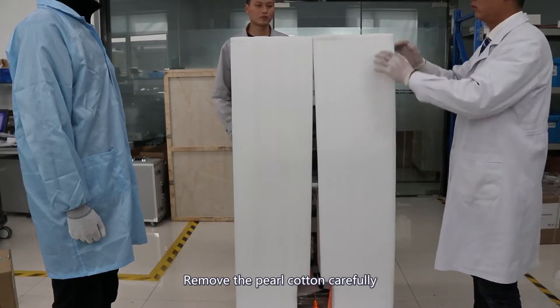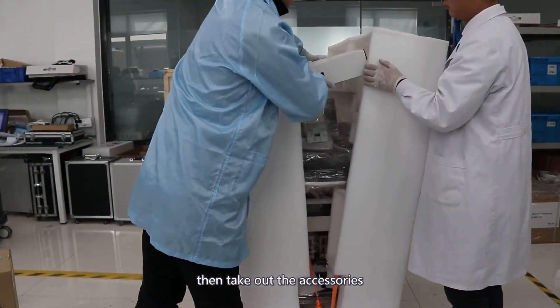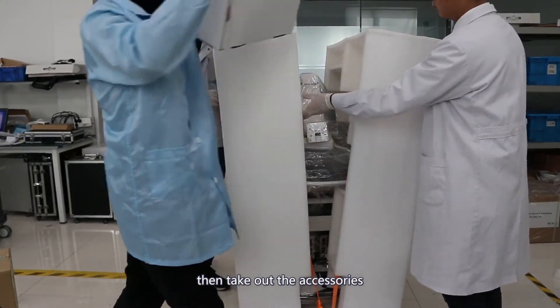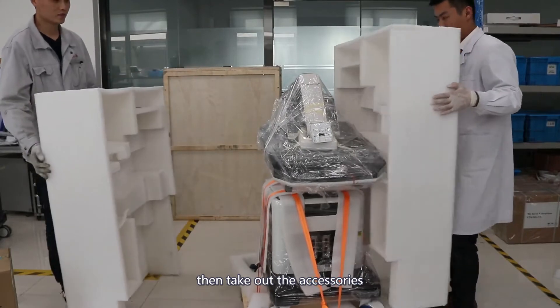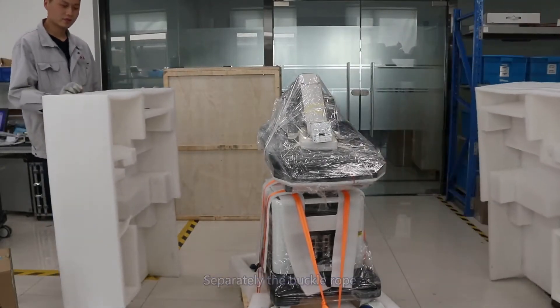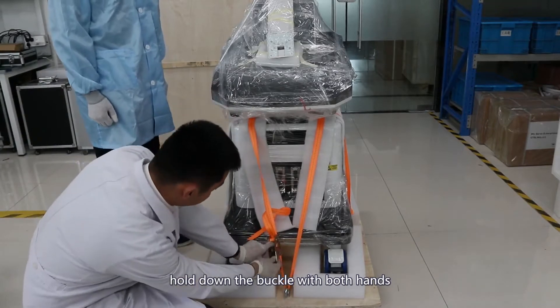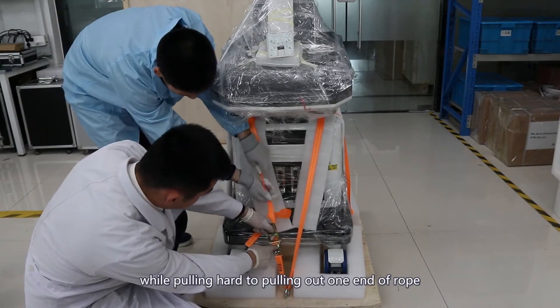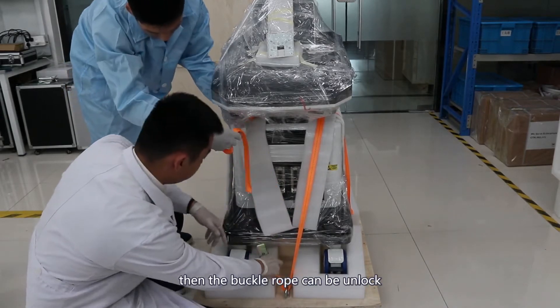Remove the outer carton carefully, then take out the accessories. Separate the buckle rope by holding down the buckle with both hands while pulling hard to pull out one end of the rope. Then the buckle rope can be unlocked.